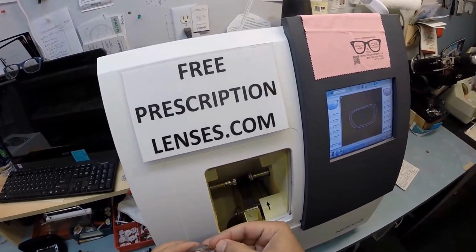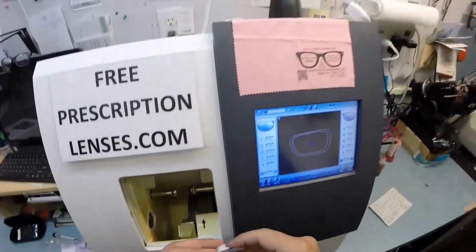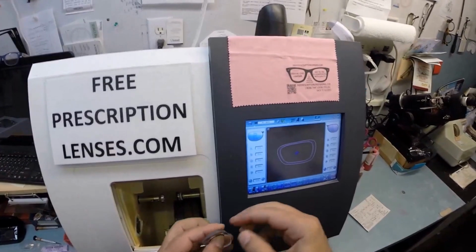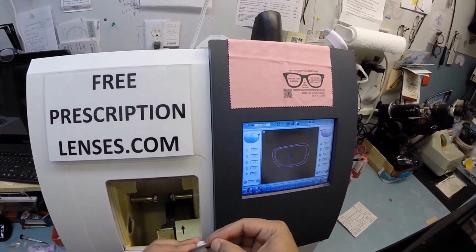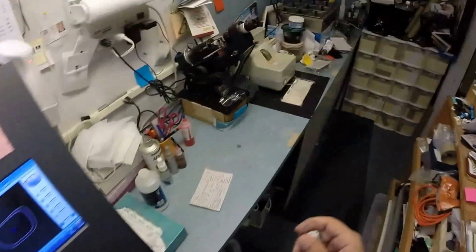Use my thumbnail to scrape all that off. Look, I love it when it comes off in one piece. You see that? It's like when you clean out the lint trap in your dryer and it comes off in one piece. Oh, that's a good day when that happens. All right, so I scrape that off and just drop it on the floor. You know why? Because it makes it look like I've been working. I can fool people that way.